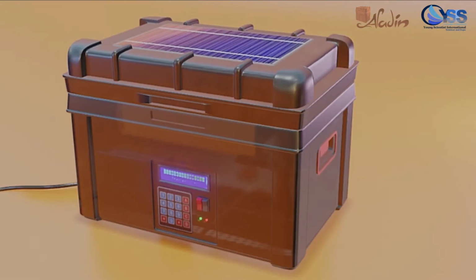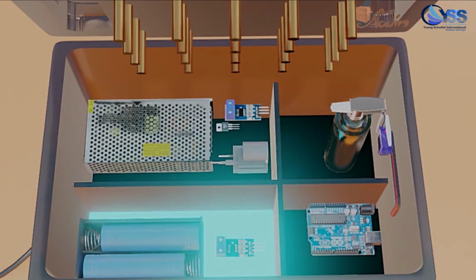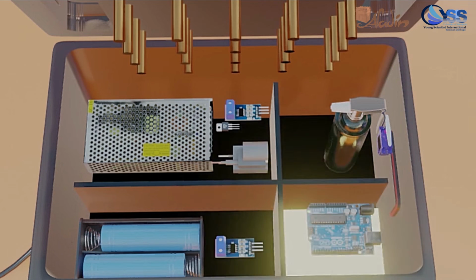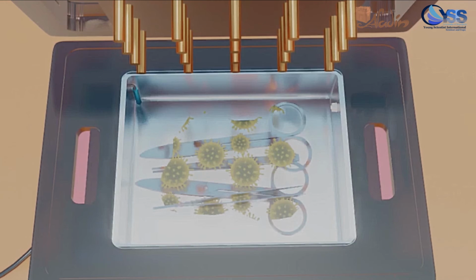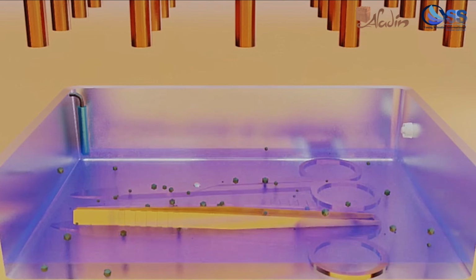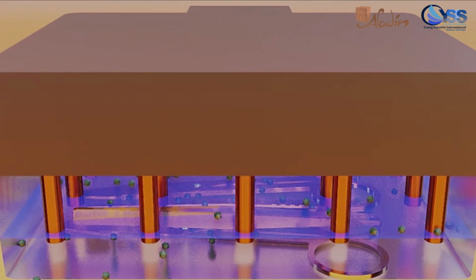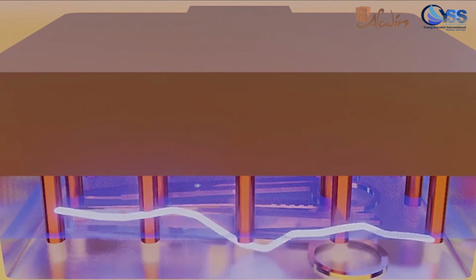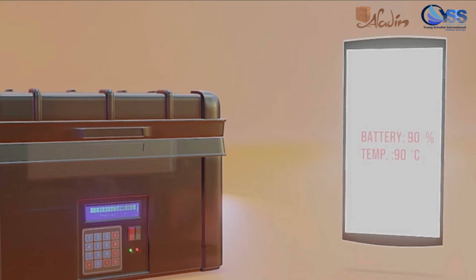The dental tool sterilization system is divided into two stages. The first stage is the sterilization stage by spraying ethanol, and the second stage is the sterilization stage using plasma, which is carried out for approximately 100 seconds. And then this process can be monitored via smartphone.